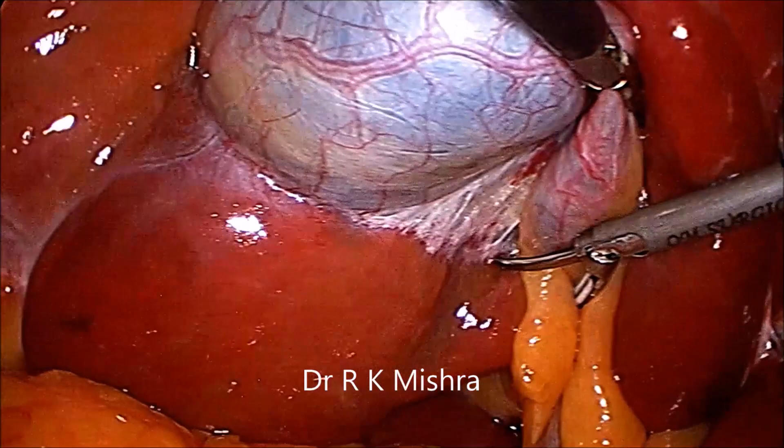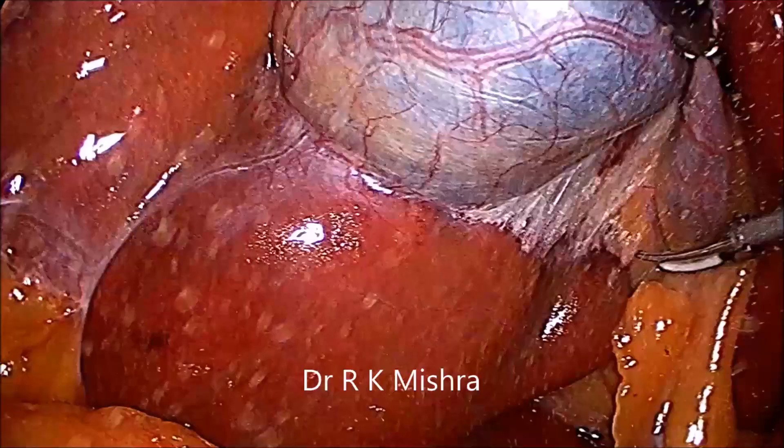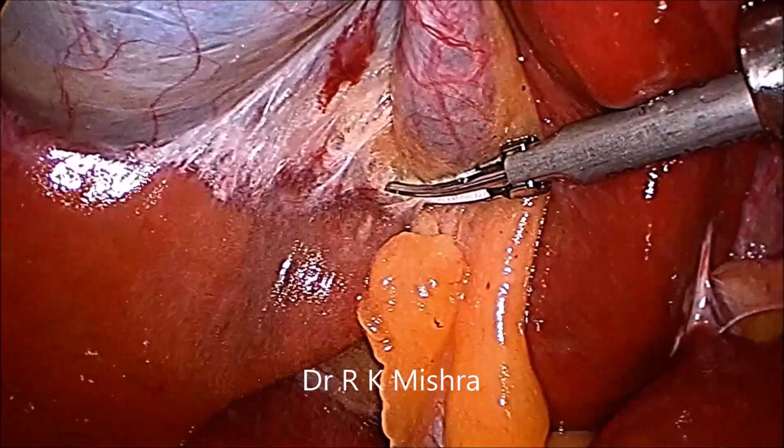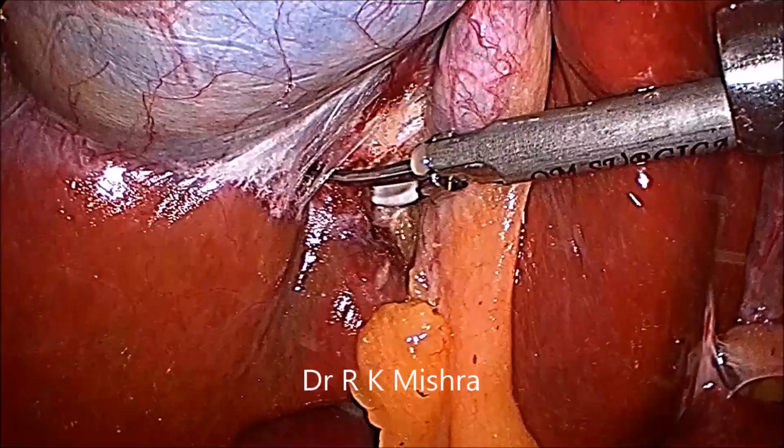We have to separate the posterior peritoneum above the Rouviere's sulcus. Here we are using harmonic. You should keep the Teflon jaw of harmonic towards the cystic pedicle, so that the vibration should not be transferred to the gallbladder. Only peritoneum should be separated.